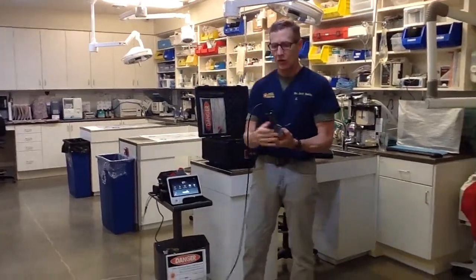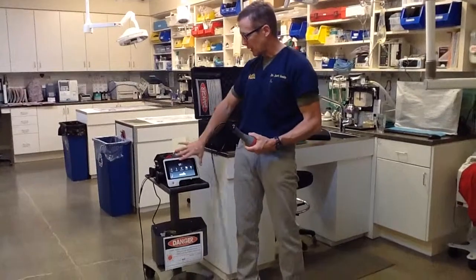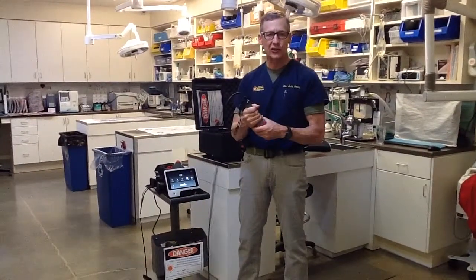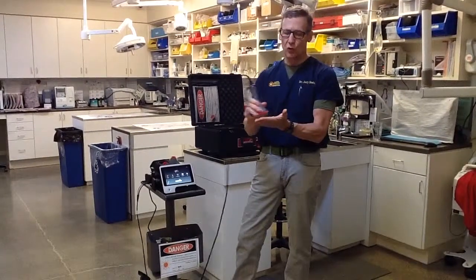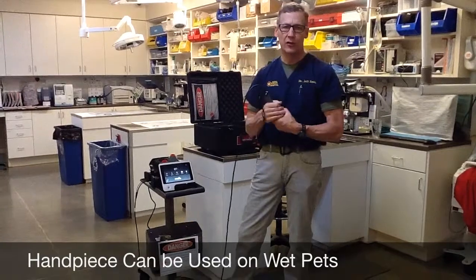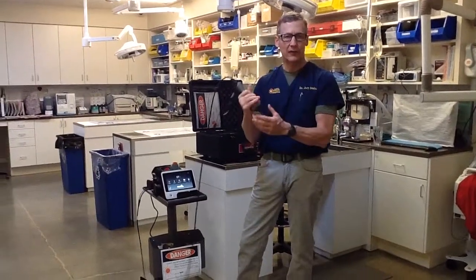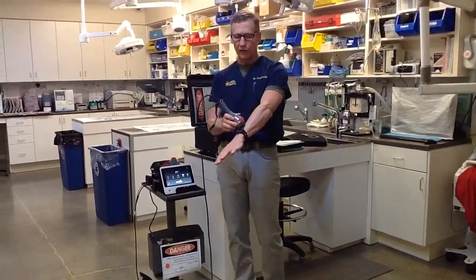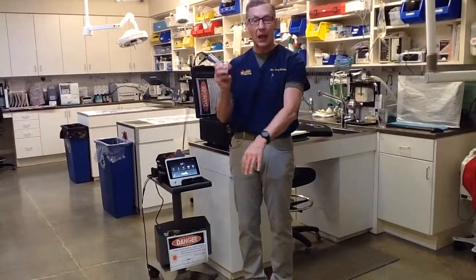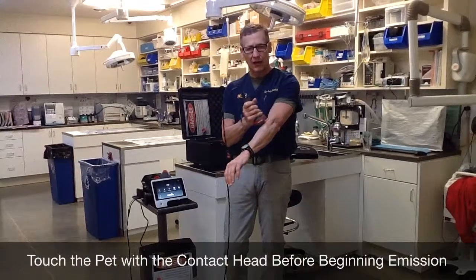You have a ten-and-a-half-foot treatment cord, giving you a lot of freedom from the laser. All the electronic components are in the laser itself, not in the handpiece — it's not like an ultrasound head; it's quite durable. The handpiece can even get moist or wet, so you can use it in a treadmill or for bathing. Try not to get the hand switch wet, but the handpiece itself is fine. When I'm lasering, I first move the handpiece over the tissue without the laser on to see if the animal is sensitive to contact, then trigger the finger switch once they're comfortable.